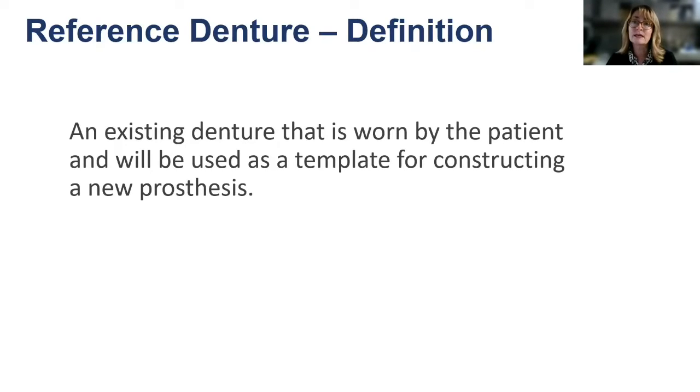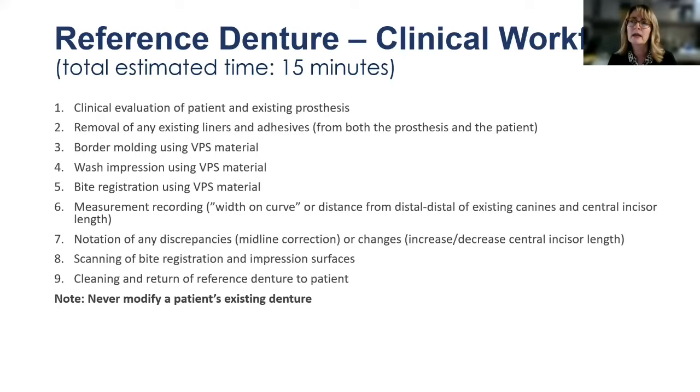So what we tend to work with the most is the reference denture. And again, the reference denture is an existing denture that the patient is already wearing. I'm not going to go through every little detail here, but you're going to really treat that denture as though it was a custom tray.